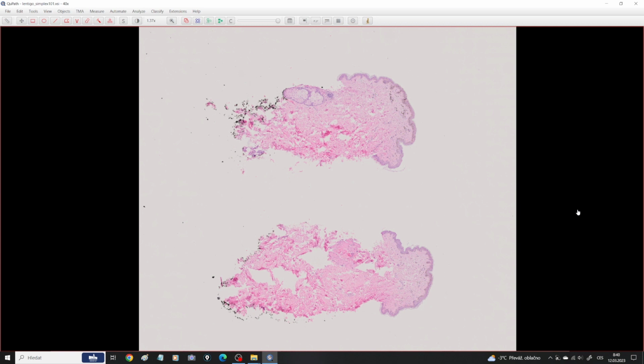Okay, so today we will discuss melanocytic lesions. This can be quite a challenging topic, to be honest, because there are a lot of subtypes of both benign nevi and melanomas, especially those that are less common. They can very easily mimic the opposite. So there are several subtypes of benign nevi that can very easily mimic melanomas, and also some less common subtypes of melanomas can be very easily mistaken for benign lesions.